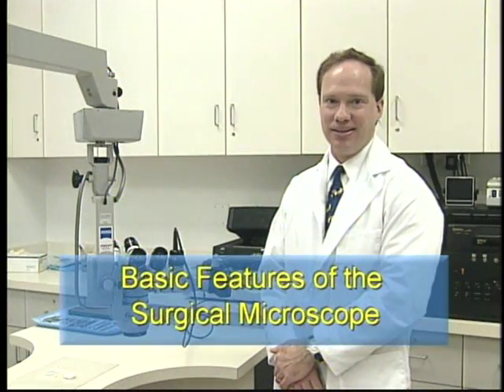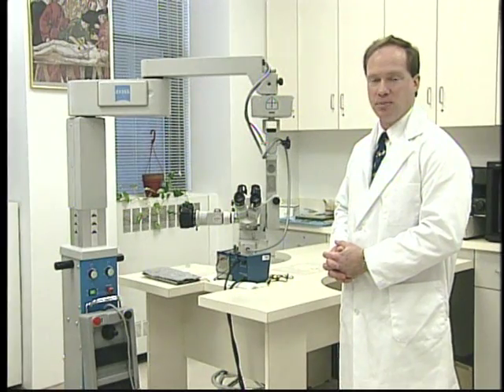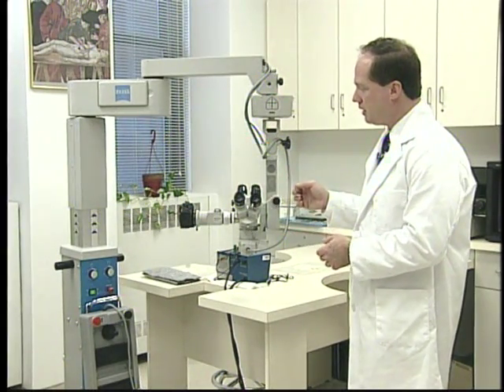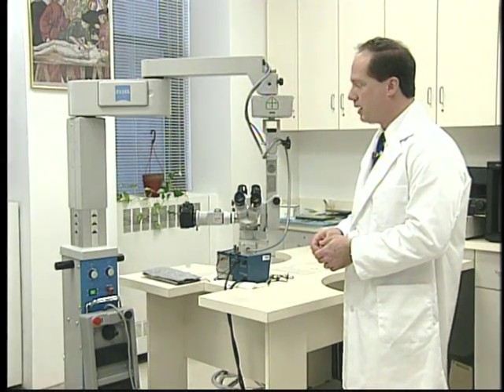Before we begin, it's important to go over the basic working parts of the microscope that you will be using. Every microscope may be different, but there are features common to all microscopes that it is important to know about. This is your basic operating microscope. This model we use in our laboratory, and it is equipped with a camera as well as an external video source for training purposes. But in the operating room, frequently the camera will not be connected.